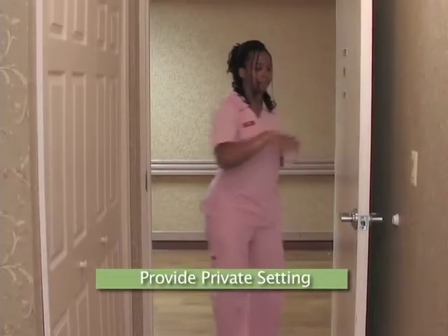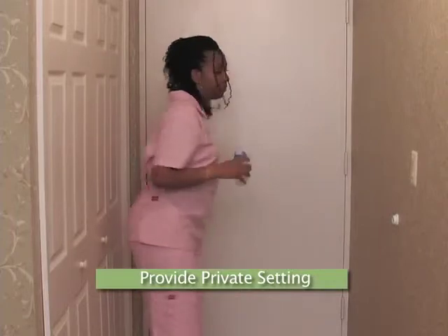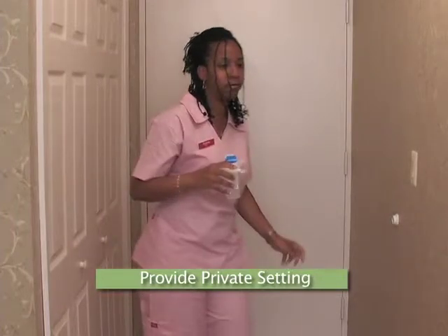With the inhaler and gloves secured in the barrier, the nurse approaches Mrs. Casa. This facility requires gloves be worn during inhaler administration, but your facility may not. Be familiar with your facility policy.